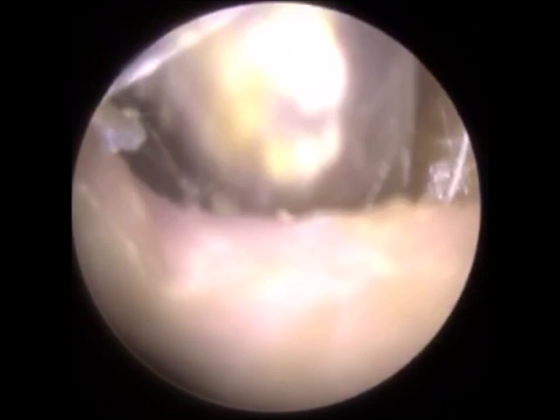Okay, so I just thought I'd come back and explain. This part that I'm focusing on, there is a cave there, there's a crater. Just in the middle of the screen right now, that's the client, you can see the cartilage, so that's the client's original ear canal wall. And to the left of it, where the suction probe is, that's the mastoid cavity.